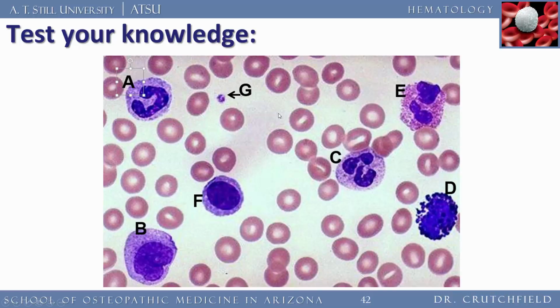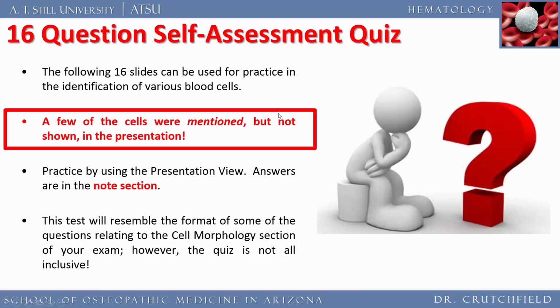So speaking of test, let's keep going and take a look at some images here that you should be able to pick out. A few of the cells I mentioned are not shown in the presentation, so you've got to go through this quiz and identify all these. The answers, of course, are in the notes section on the PowerPoint, and the questions that I'm going to write for your test will come mostly like a point and identify. Tell me what kind of cell this is. Tell me what's in the granules. What would you see clinically? Is this a viral infection? Is this a bacterial infection? Stuff like that.